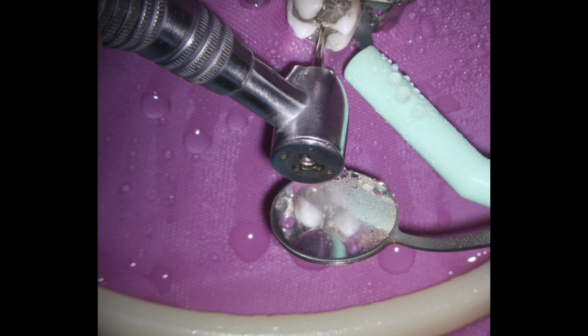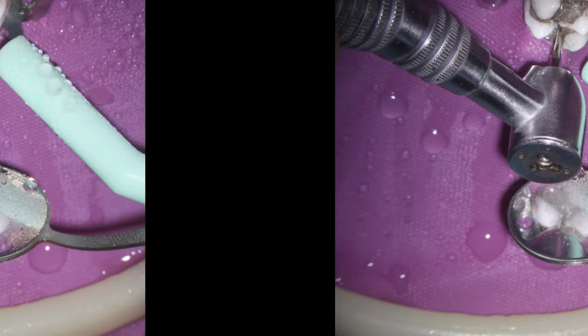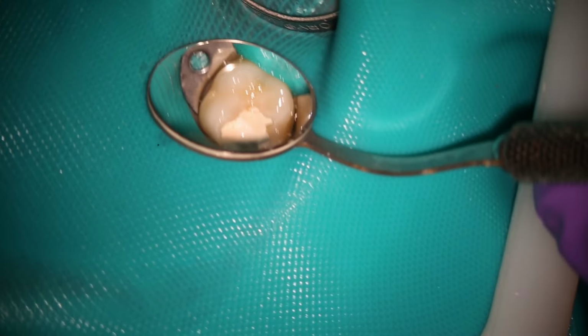Most endodontists work similar to this, and their mirror gets sprayed with the handpiece or the irrigation solutions, and then it requires the assistant to completely clean the mirror. But if you move the mirror away, as you can see here, down below the level of the dam, then the water spray or the irrigation solutions don't fog the mirror.